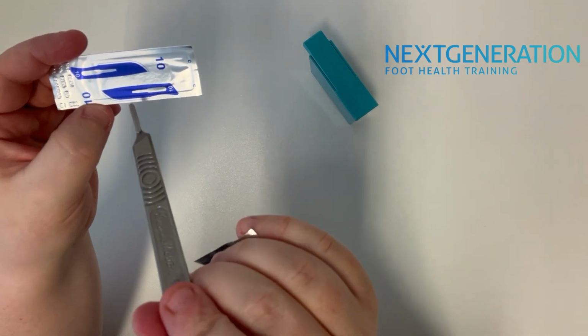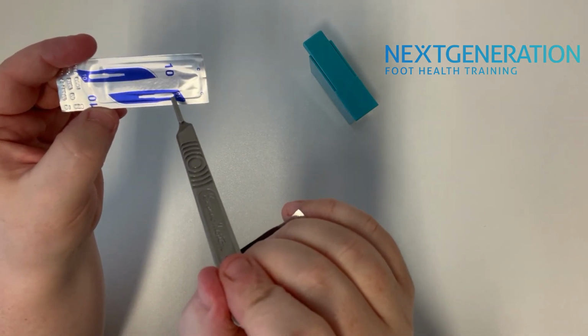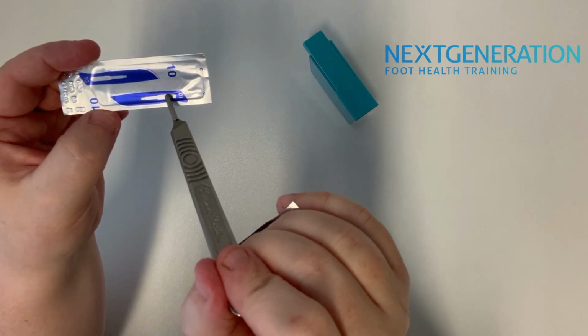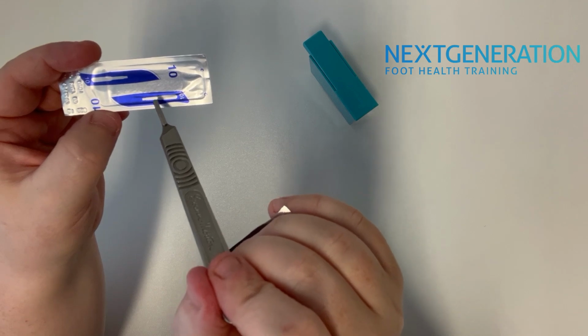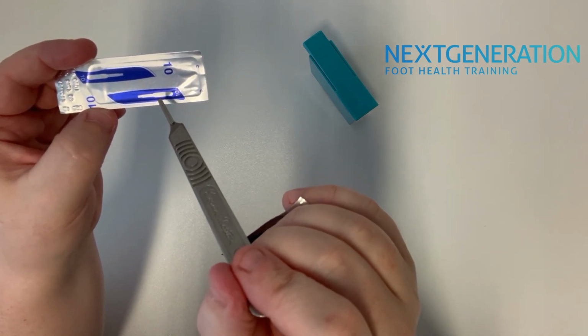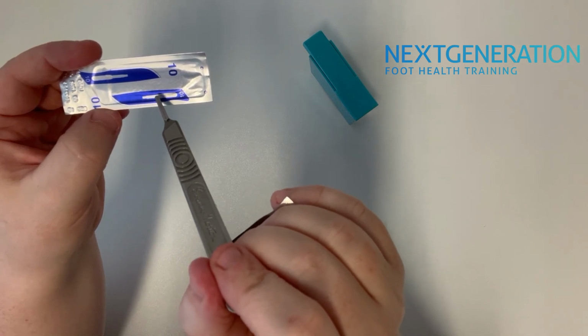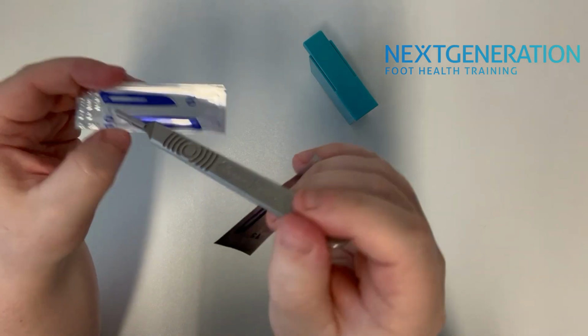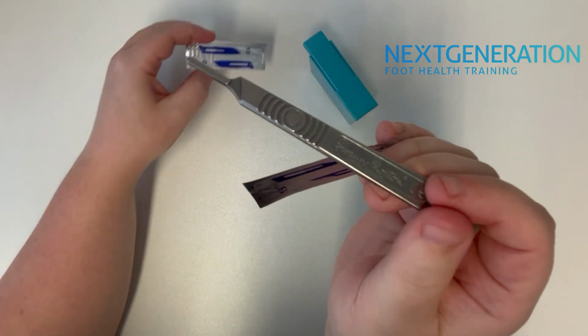And if we look at the blades themselves, obviously it gives the shape as well as the number of it, but you can also see that you've got quite a wide hole there in the middle of the blade, and then it goes a little bit narrower there. So when we're actually applying the blades, which I'll run through in a second or two, we need to concentrate on those narrow parts there, because when it gets narrower, that's when it attaches to those little grooves around the tip of our handle piece.